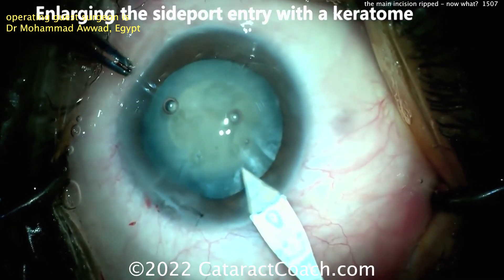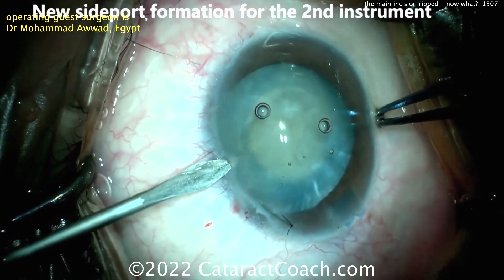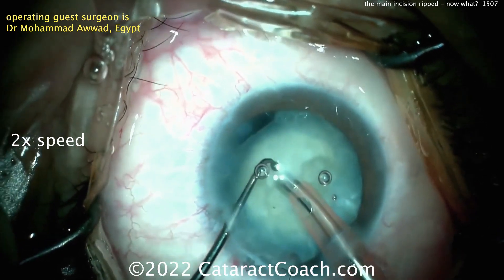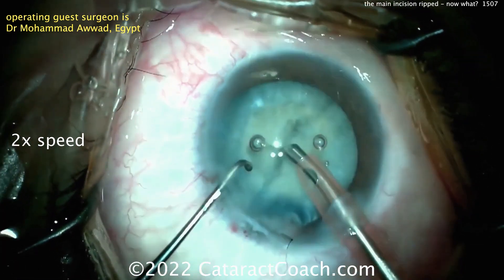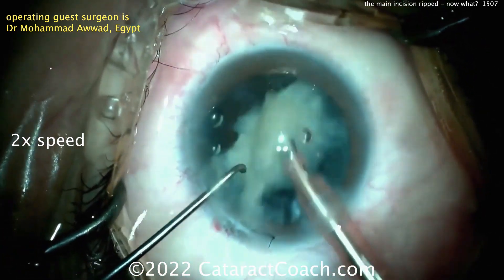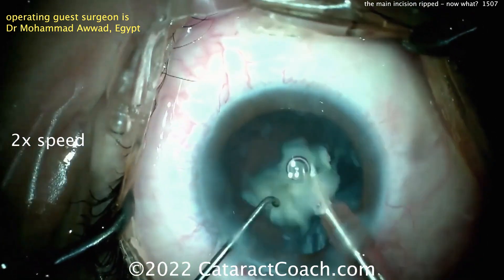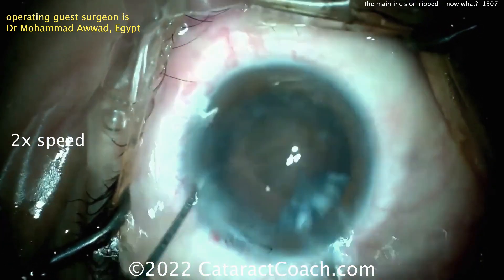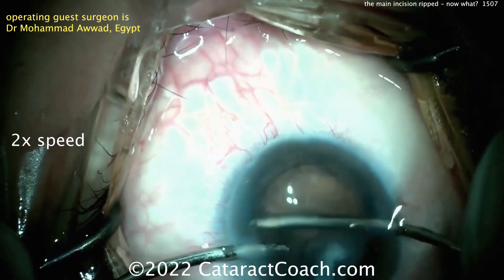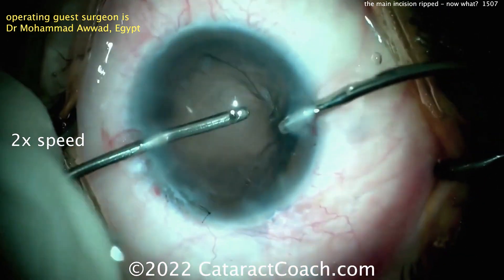Now making a new entry into the eye. There's a new FACO incision to the right of the ripped one and a new paracentesis to the left of it. The nucleus can be removed. You've restored the fluidic balance in the eye. There's still a little leakage from that ripped incision where that suture is. I definitely like the idea of abandoning the ripped incision and making a new one — abandon the bad incision, don't stick with it. It's going to cause more harm than good, and you can always make a second incision elsewhere.